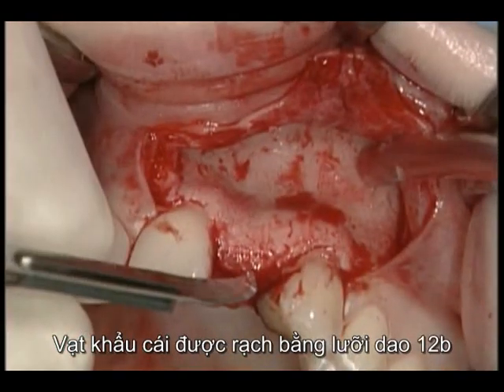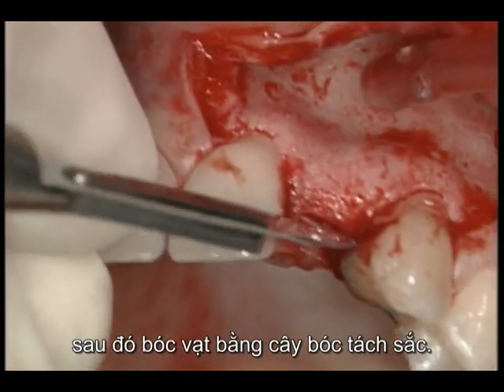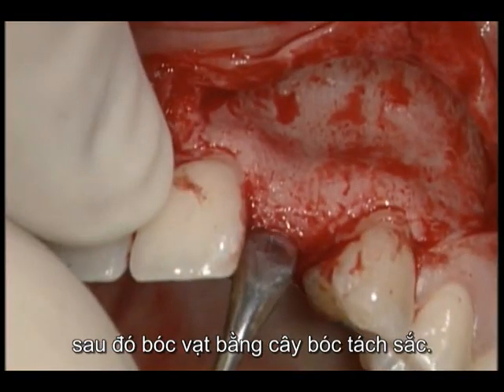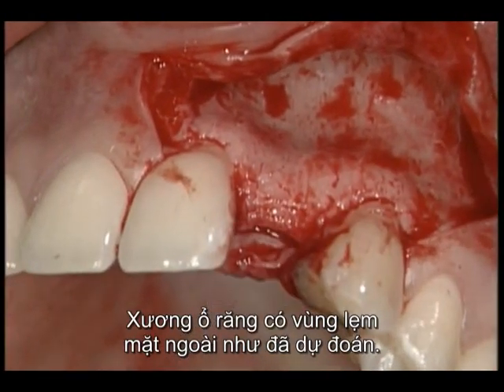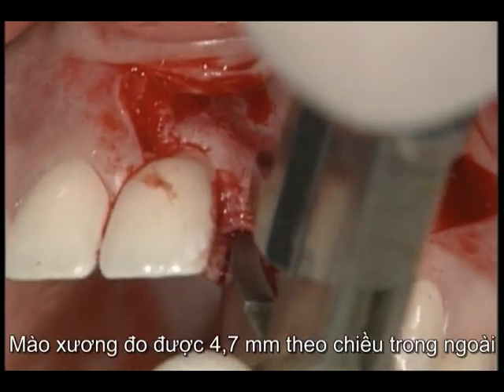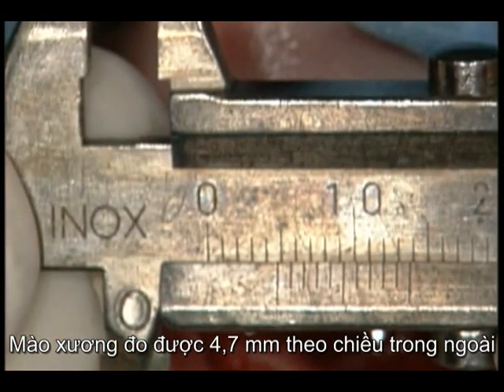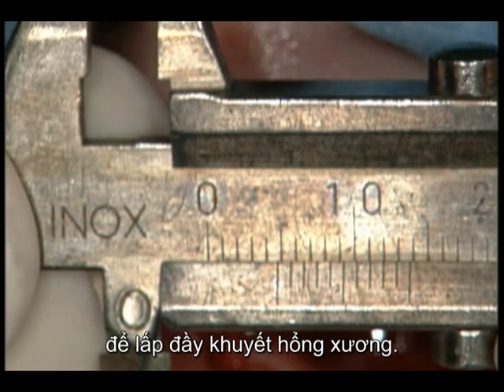The palatal flap is cut using a 12B blade. The flap then is mobilized with the fine tissue elevator. The alveolar crest reveals the expected facial undercut. The crest measures 4.75 millimeters in orofacial width, suggesting that implant placement will be combined with a simultaneous GBR procedure to augment the bone deficiency.